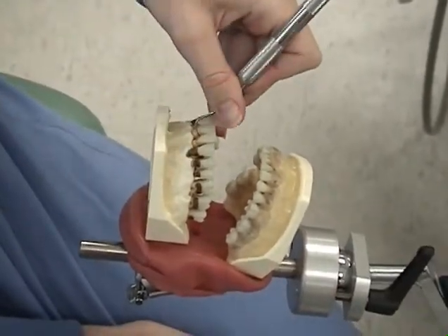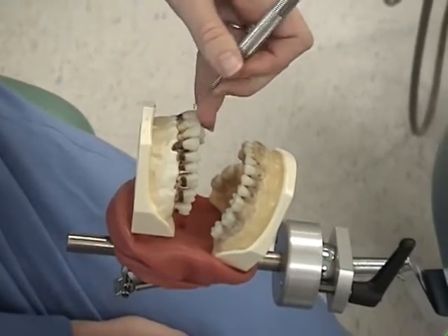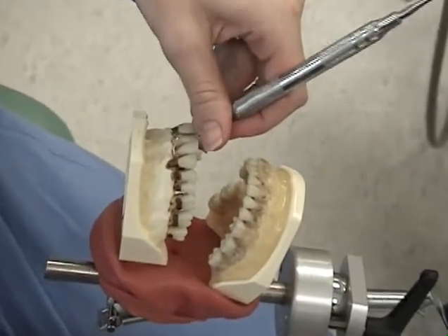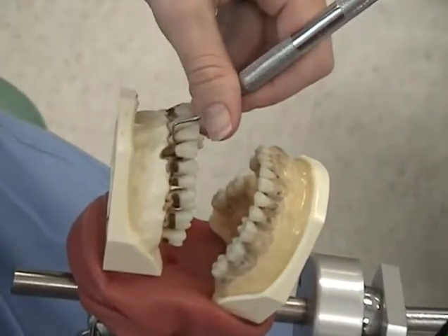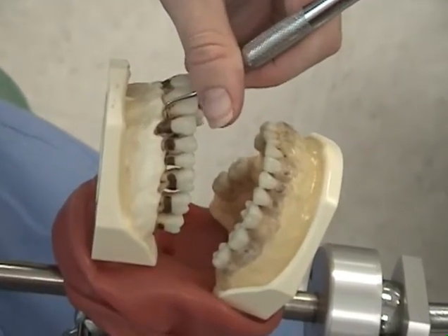Check that all visual clues are correct: is the terminal shank across the tooth surface? Is the handle parallel? Is the toe third adapted correctly? Is the toe starting at the midline of the tooth?